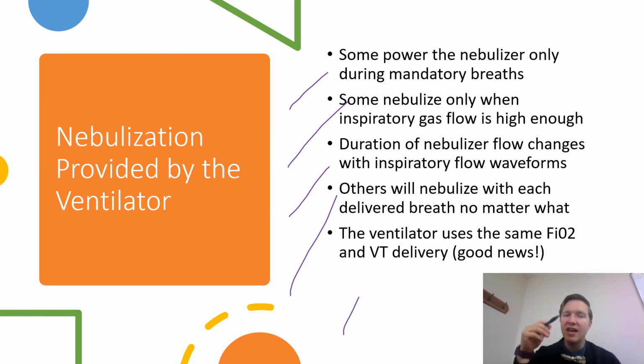And then the advantage here is the ventilator uses the same FiO2 and tidal volume delivery. So we don't have to worry about their tidal volumes going really high with nebulizing using the ventilator's nebulizer mode. That's a good thing, right? We don't have to worry about the FiO2 changing for oxidative injury or causing desaturation or anything like that.